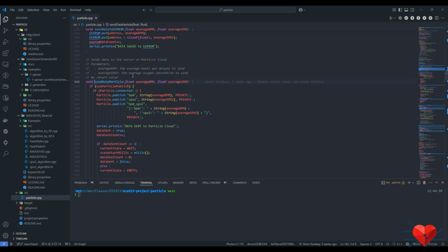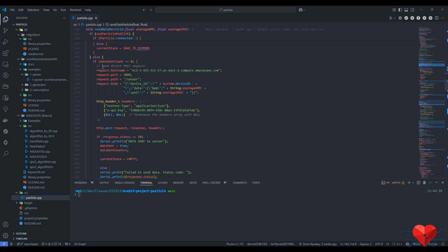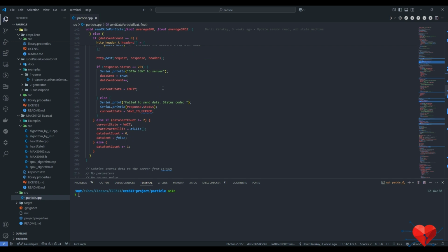So if I go to the send state, we utilize 2 different methods to send the data. There's one if you use the particle itself. So there is the particle interface, which I utilize to send the data to our server. I first send to the particle, then from there I utilize a webhook to send it. But there is another way to do it. If we directly send the POST request to our server, we were able to do that, and we have the API key here. We are also checking the response.